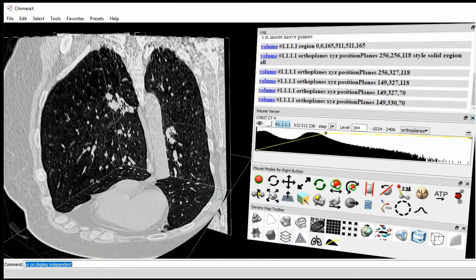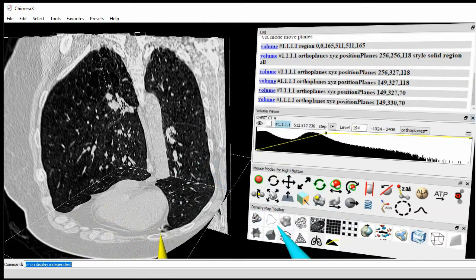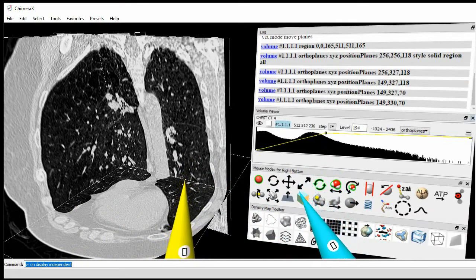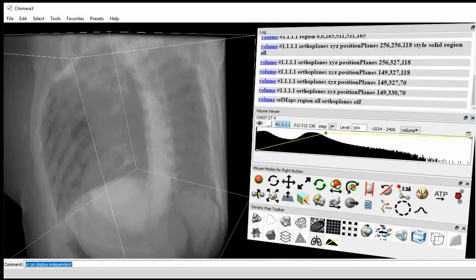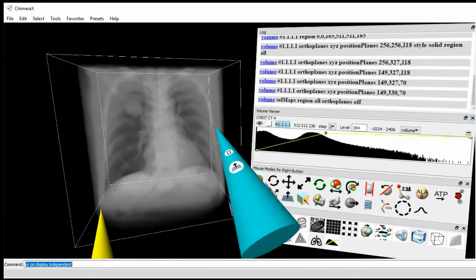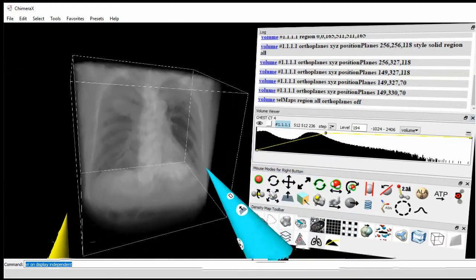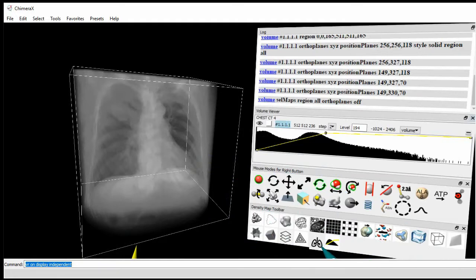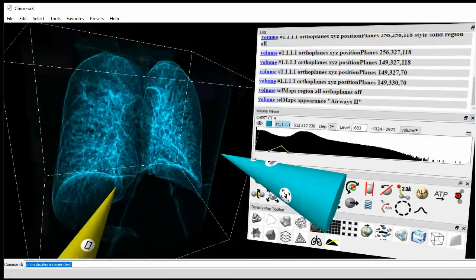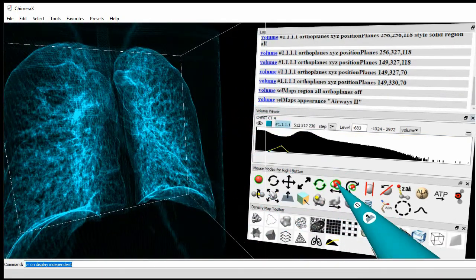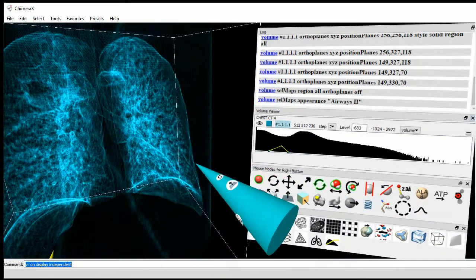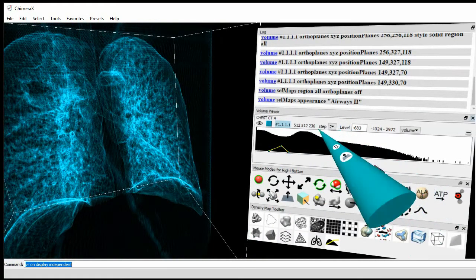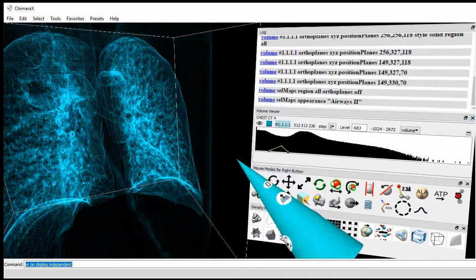What I want to do now is look at a full three-dimensional piece of the data, in particular, a slab of the data. The little cube icon on the bottom row here, I'll click that, and it will show me the full data. It's kind of a smoky gray volumetric rendering. I want to look at the airways in these lungs, and there's an icon to show those. It's the little lung icon, so I'll click on that. What that did was it changed the color profile, and that's the yellow curve on the histogram. I see above the histogram it says step two, and that means it's not showing it at full resolution. It's showing every other data point along all three axes. To change to step one, there's an icon at the bottom. It's the little grid pattern, the black grid pattern. If I click that, that will show the full resolution data. I see it says step one now.